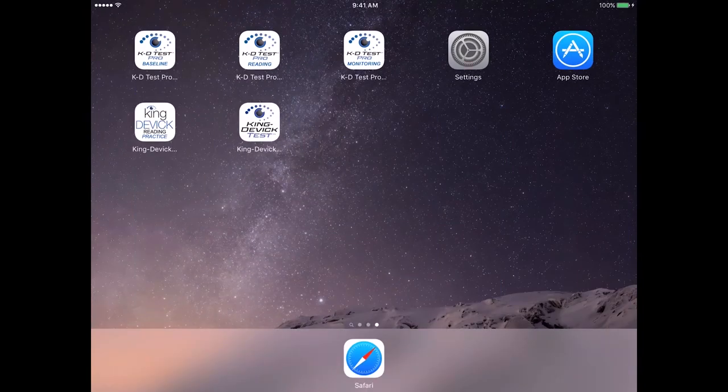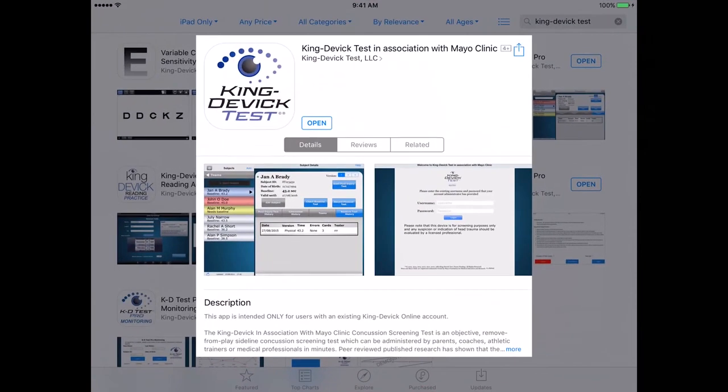Be sure that you're running the latest version of the KingDevic test app for optimal performance. Launch the App Store app and enter 'KingDevic test in association with Mayo Clinic.' If the app says Open, your app is up to date. If it says Update, tap Update to download the latest version.